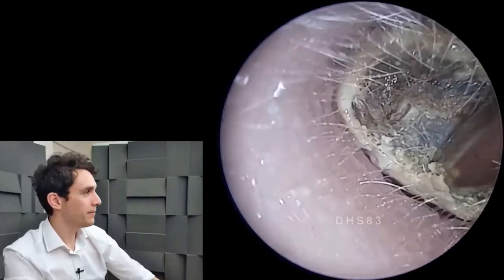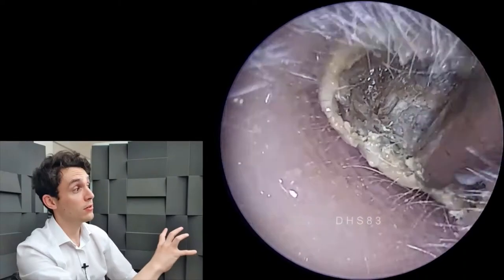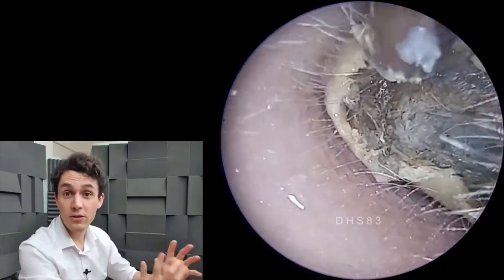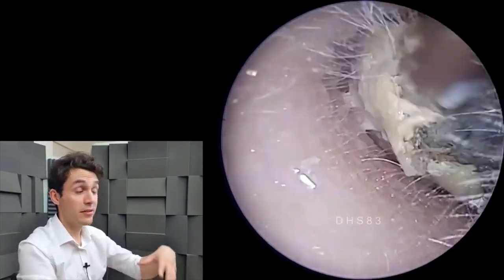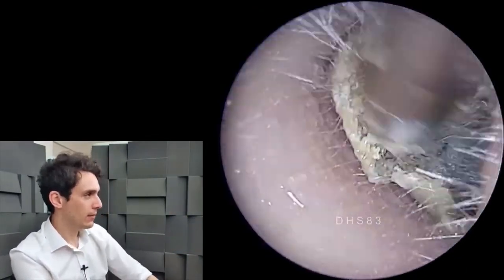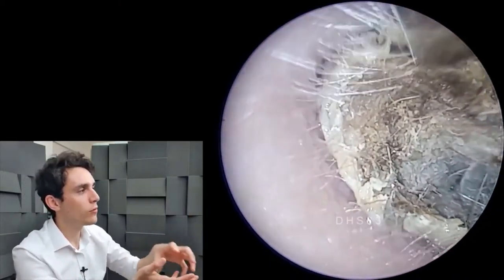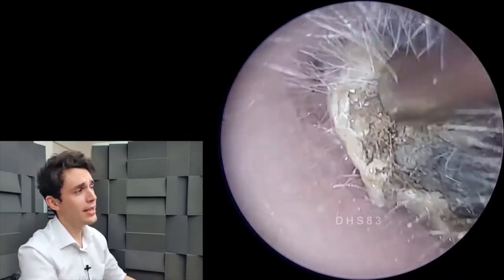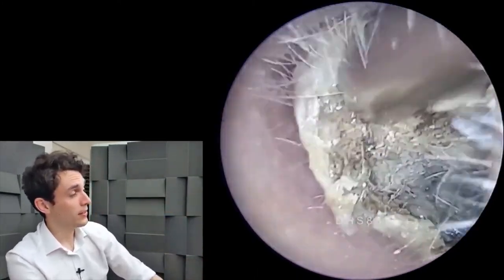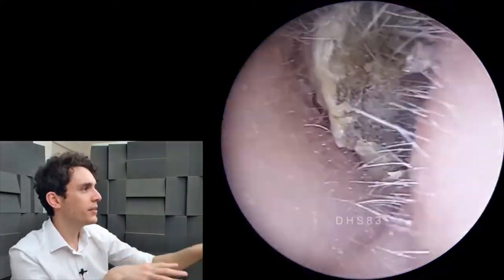As you can see, I've had a lot more success here with this dead skin plug. The patient, although they didn't mention eardrum perforation, did mention very recent ear infections in both ears a couple of months ago, so I rather suspect there's a relationship there. There is a very clear relationship between otitis externa and lots of desquamation — dead skin shedding into the ear canal. At this point a lot of faffing ensues because this plug is a very awkward shape and a lot larger than the aperture of the ear canal, which is often the case. I eventually reach for a cawthorn hook, thinking that would save the day, but I'm going to have to use the Clearway again.